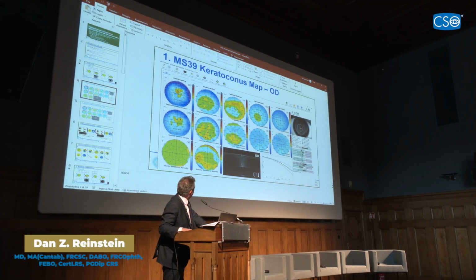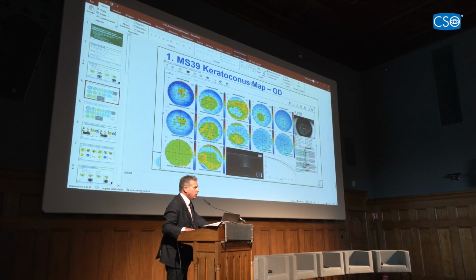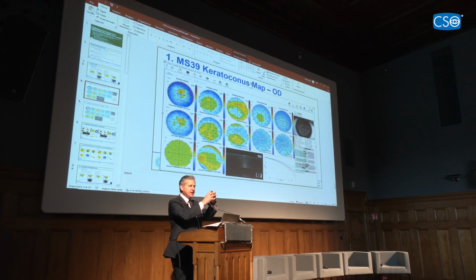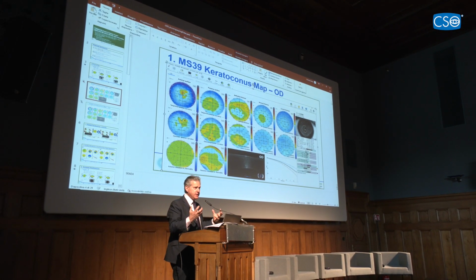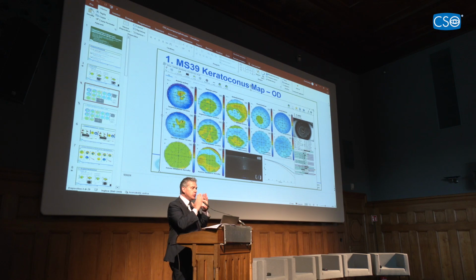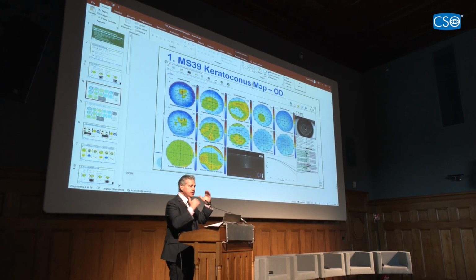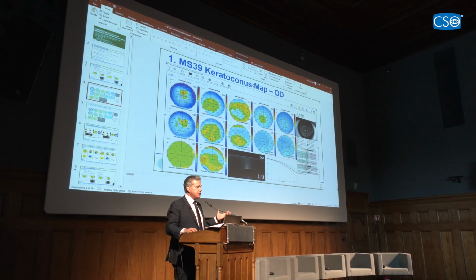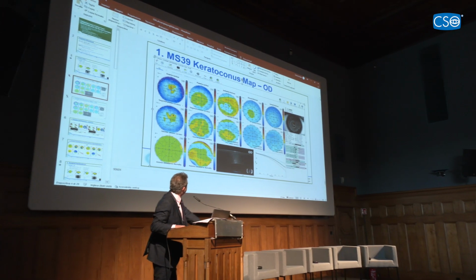As you can see, you can right mouse click on this scale and get what's called a normalized scale, so you expand the scale of the epithelium. And you should always normalize the epithelial scale because you're looking for 3-4 micron differences. And if the color scale is set wide, the whole thing is green, even though there are 3 or 4 micron differences. So always normalize the epithelial scale.